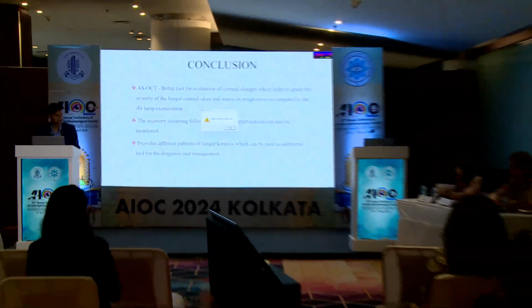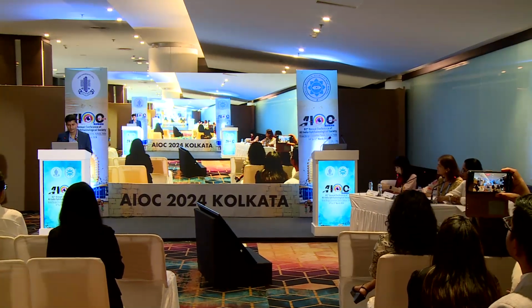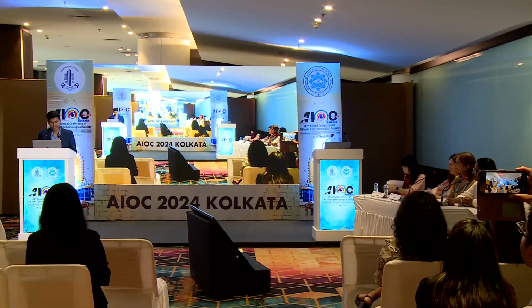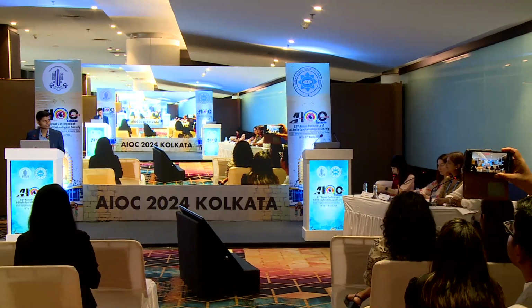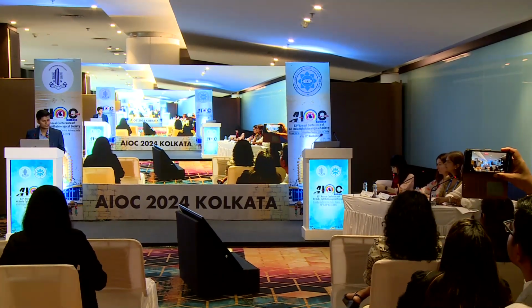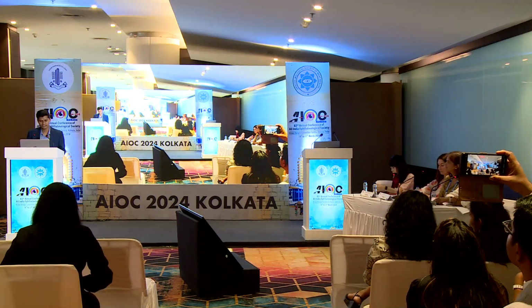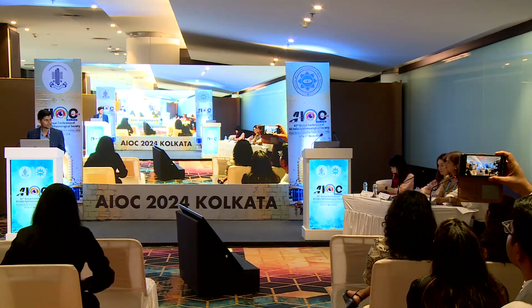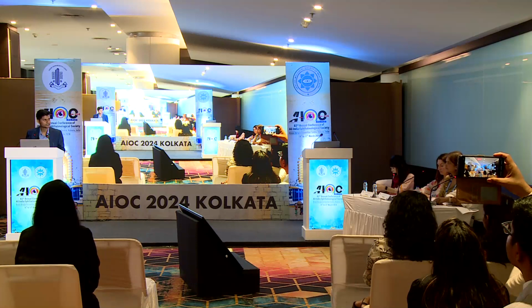How is this monitoring by ASOCT going to change the way you manage your patients? Yes, ma'am. We measure three parameters: corneal thickness, infiltrate thickness, and also the infiltrate width. By ASOCT, we can also measure the signs of scars, such as a hyperreflective area with defined margins. That's how. Okay, thank you.